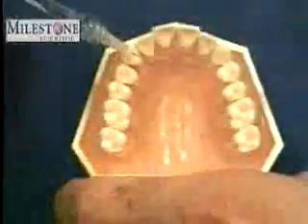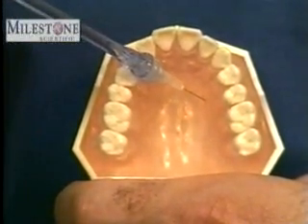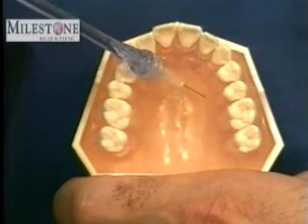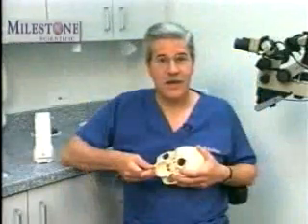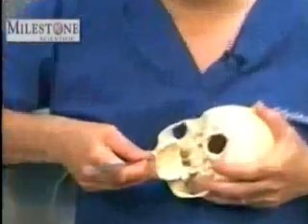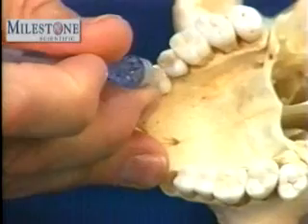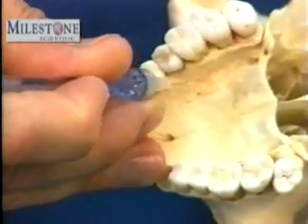The landmark for this injection is at a point which bisects the premolars and is midway between the free gingival margin and mid-palatine suture. The site is the same on the opposite side. The landmark for the AMSA will vary somewhat depending upon the anatomy of the palatal vault. A more appropriate description may be between the premolars and at the junction of the horizontal and vertical component of the palate.